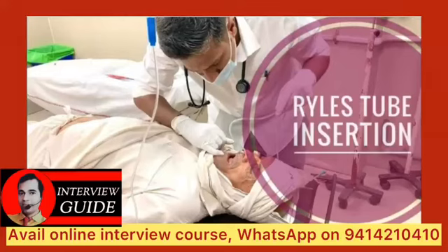Ryles tube insertion. First is uses. It is used for gastric lavage, in organophosphorus poisoning and drug overdoses. It is used to give feeding to unconscious and uncooperative patients. Drugs can also be given through Ryles tube in unconscious and uncooperative patients.